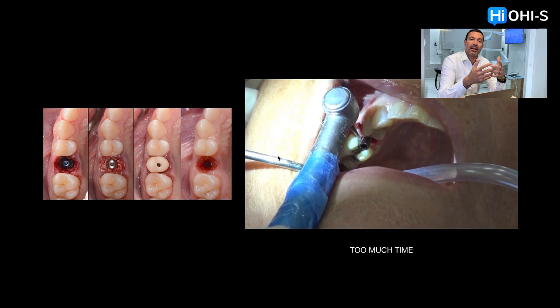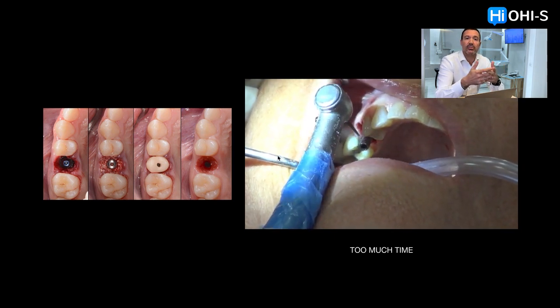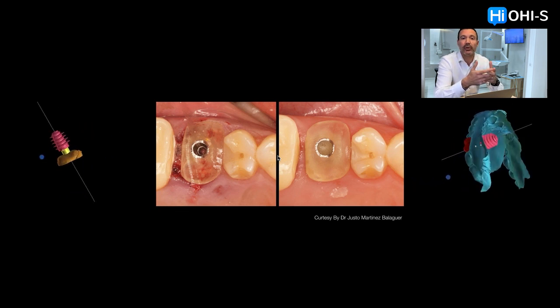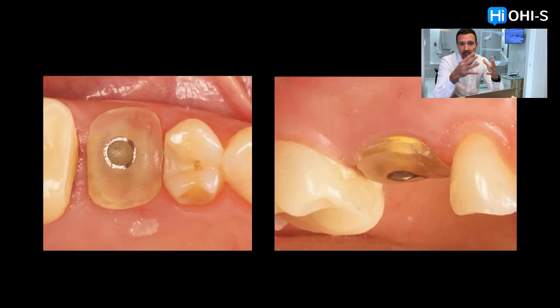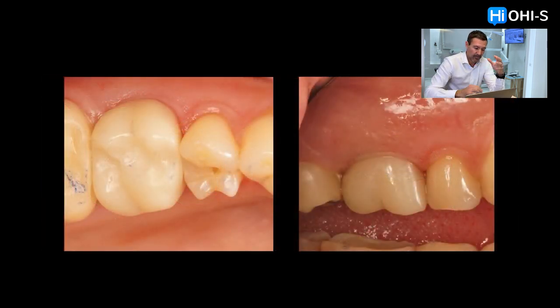At the same time, I need to achieve and ensure primary stability, work on the prosthetics, avoid micro movement, and keep an eye on the treatment for long-term results and stability of our implant, especially during the osseointegration process.